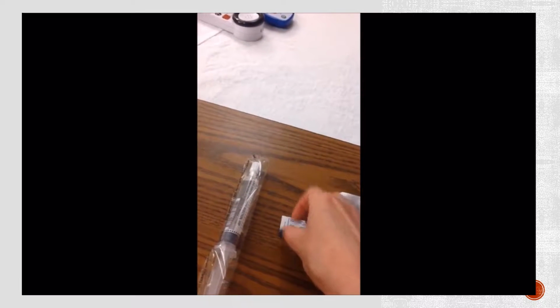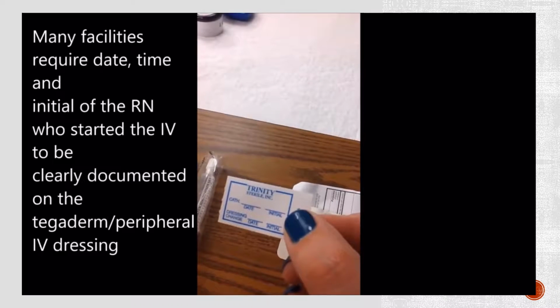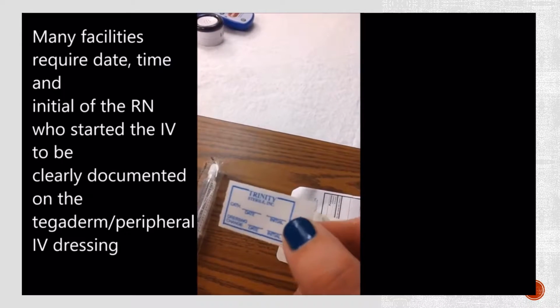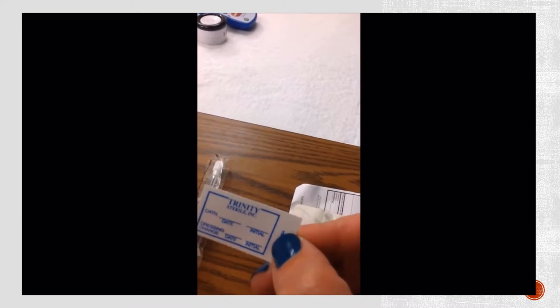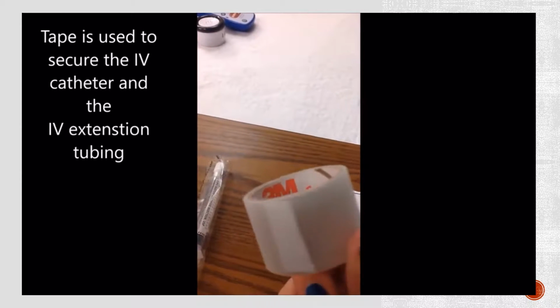And here you have where you can label the date and initial of the dressing change after you stick on the tegaderm over the IV catheter. And here you have some tape. It's essential for starting an IV.